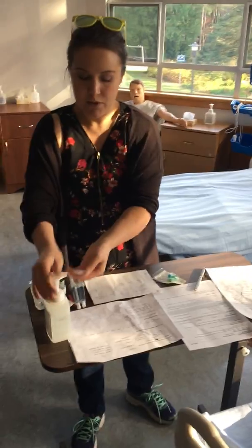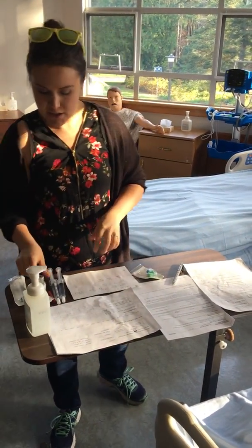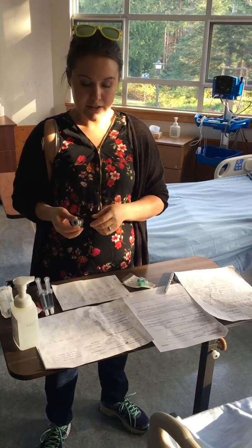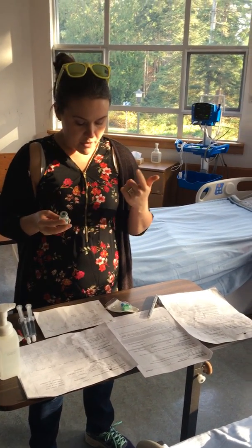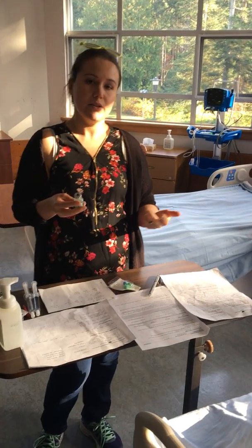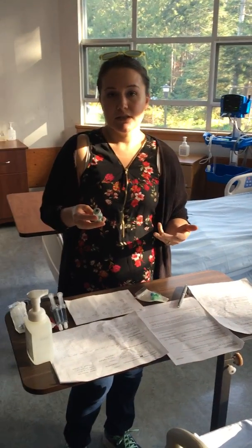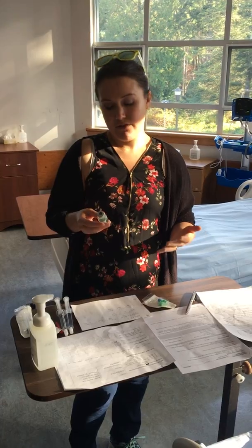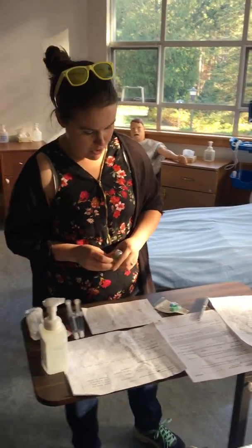So I'm going to perform hand hygiene, and I'm going to take the medication out of my Omnicell and do my first set of checks. So right patient, Sue Brown, right drug, naloxone, right dose, 0.1 milligram, which is going to be diluted into 2.5 milliliters. Right reason is for low respirations. Right route is IV. Right time is whenever she needs it, and right documentation that it's on my MAR.